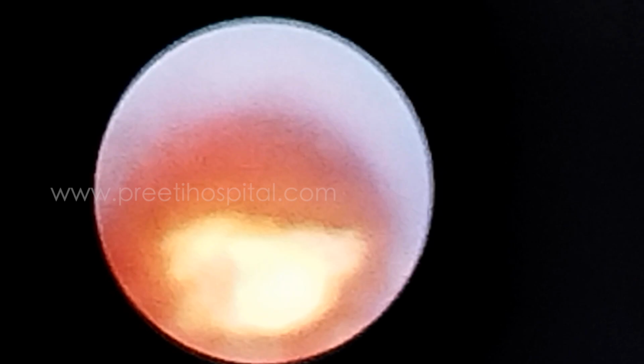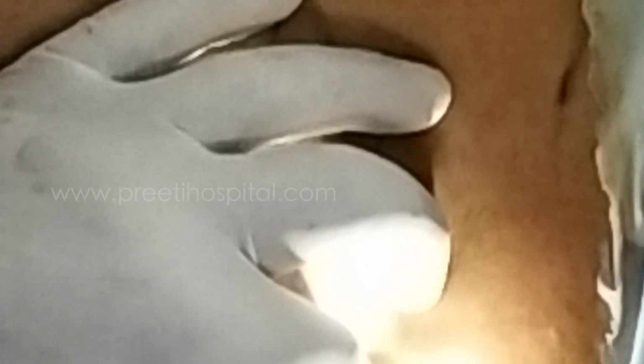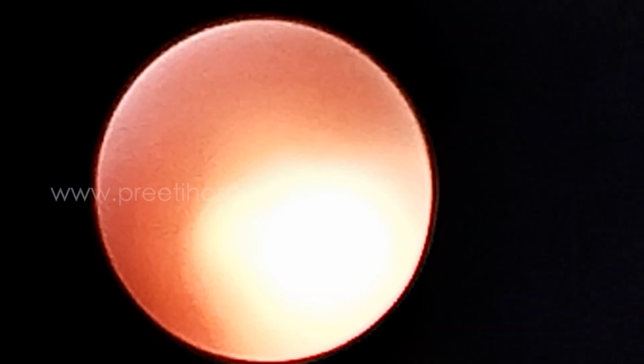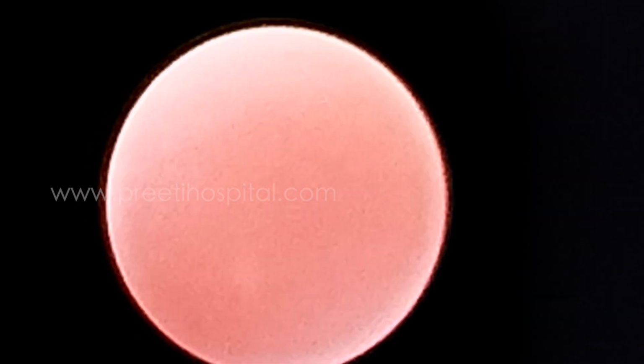Now flush from below. Can you see now clearly? All this mug, flush. Yeah. Suck. Okay, leave it. See. Flush. Stent ready. Okay, once wait, flush.